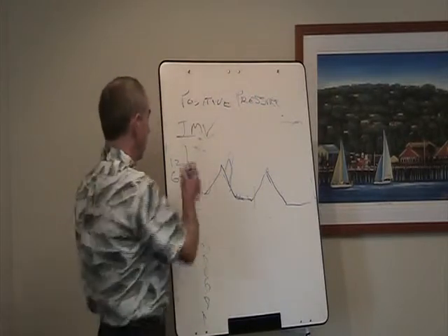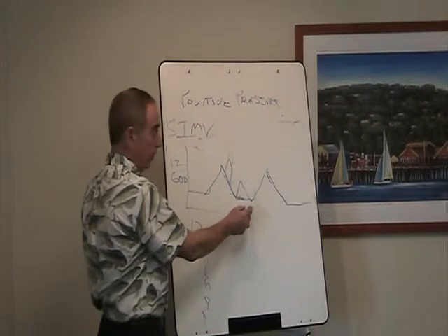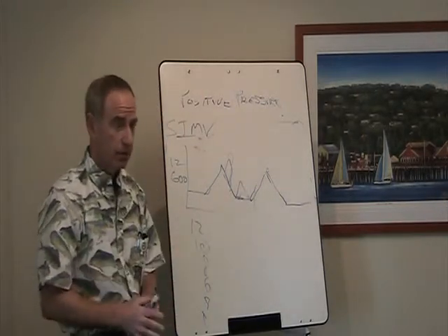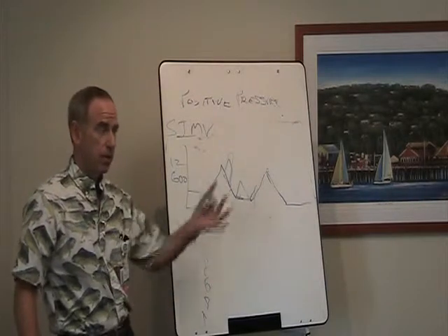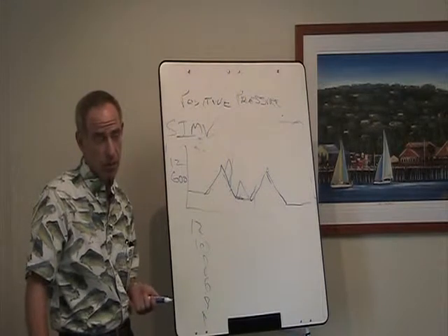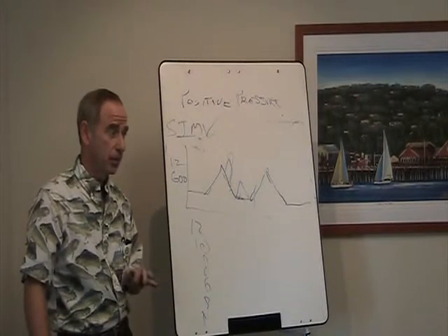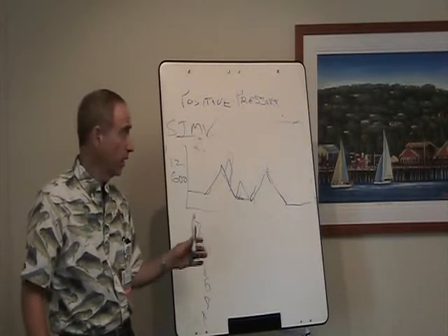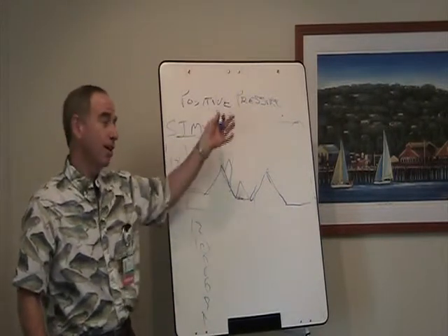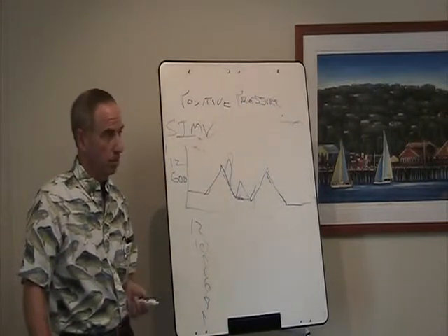It's called SIMV. What it did was the ventilator would sense when the patient took a breath, and then the next mandatory breath would trigger at that point so that they weren't stacked. So it would sense the patient's breaths, and then trigger the mandatory breath after that so that there was synchronization. So this wasn't really a big problem, but the ventilator companies made it out to be a really big problem, and they sold an entire generation of ventilators based on the S. There was no difference in the ventilators other than that between the prior generation and this generation. Okay, so the SIMV came out probably in the early 70s.